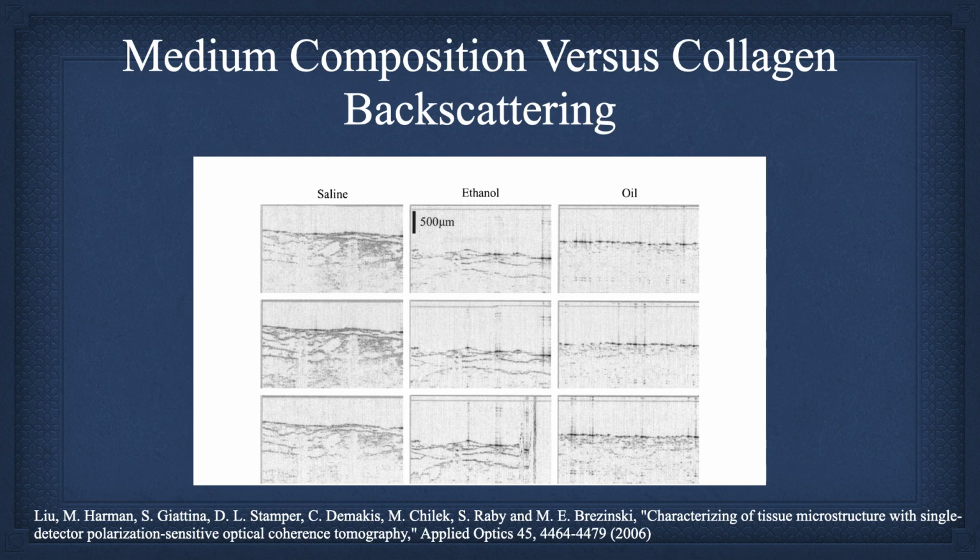But here is one of my issues with that, besides the sample size and the potential that severely diseased, we said in the two papers, the ones that had ACS had severely diseased coronaries by angiography. Well, it's hard to find healing within all that disease anyway. That plaque I showed was a brick.